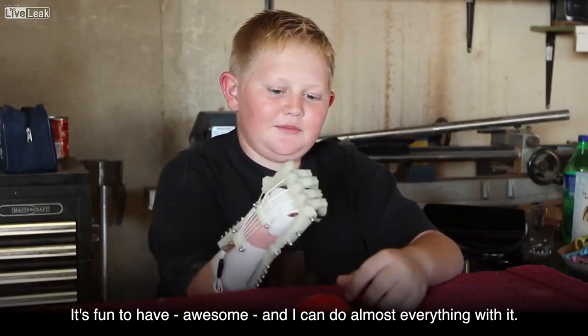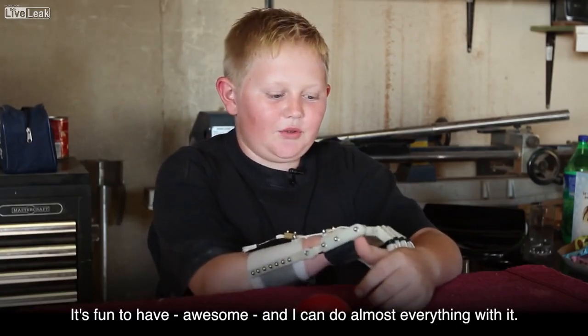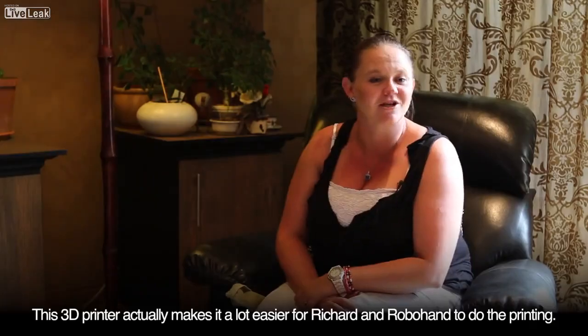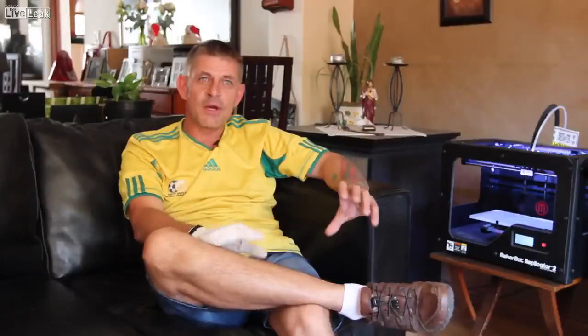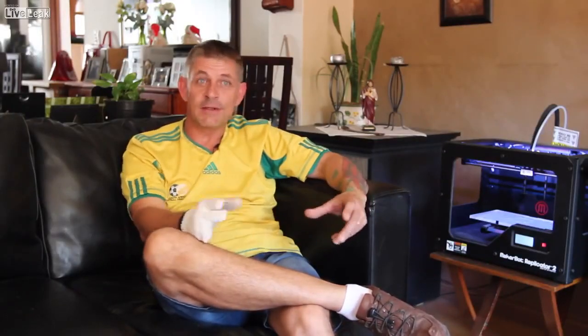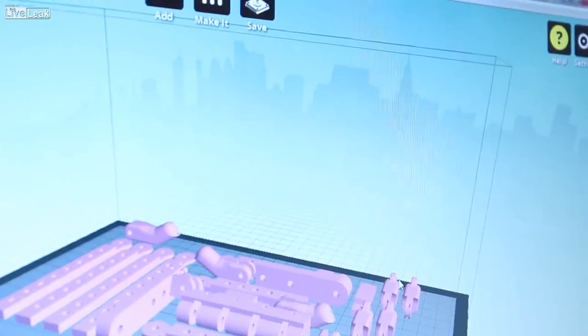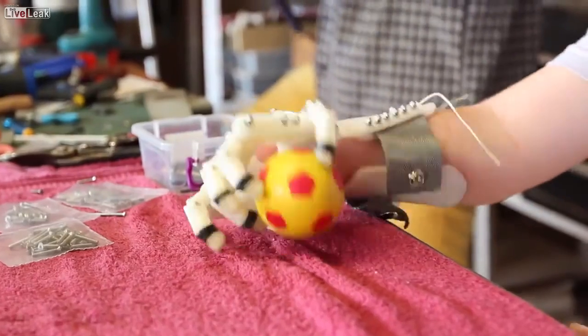It's fun to have — awesome — and I can do almost everything with it. When you're making one of these hands and you make a mistake, drill something wrong, or break a part, you just set up the machine and print a whole new set of parts. This 3D printer makes it a lot easier for Richard and Robohand to do the printing. The MakerBot and being able to swap files via the internet cut our prototyping time down from a week to 20 minutes — it was incredibly fast. For a first-time user, he's pretty amazing, and you can see he's open to the hand doing things he wants to do.